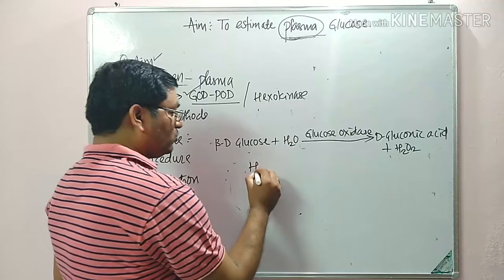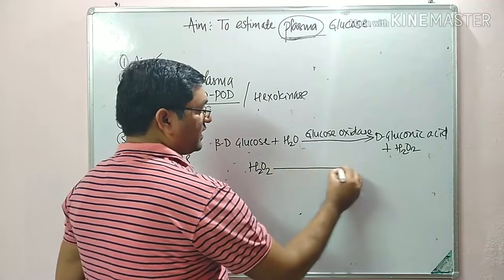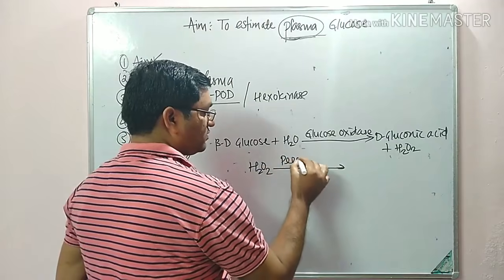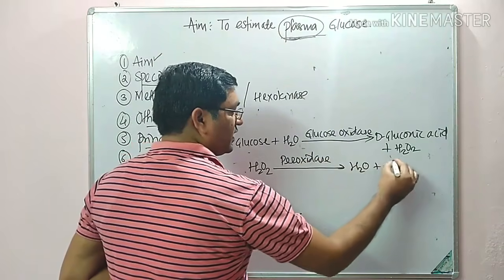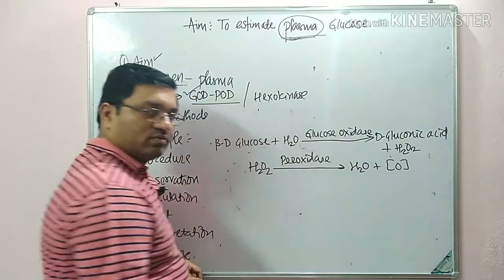This H2O2 is acted upon by peroxidase to give water molecule and nascent oxygen.